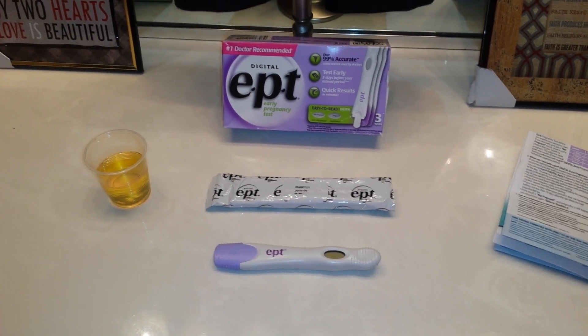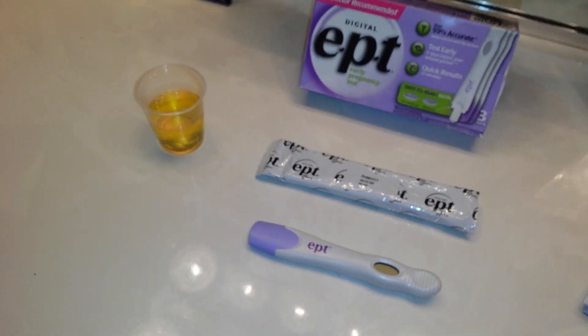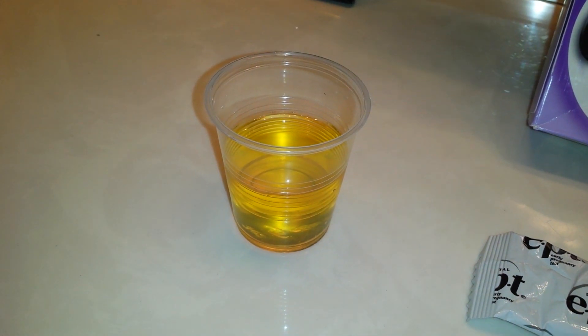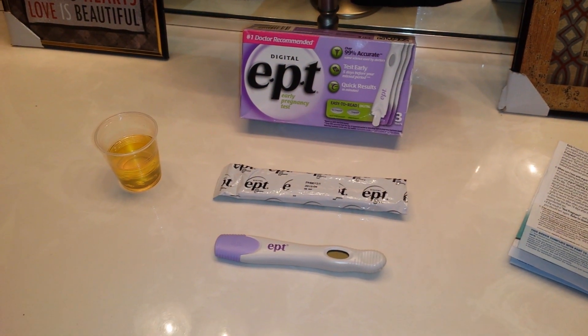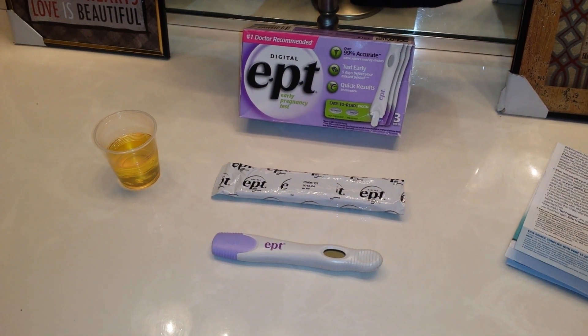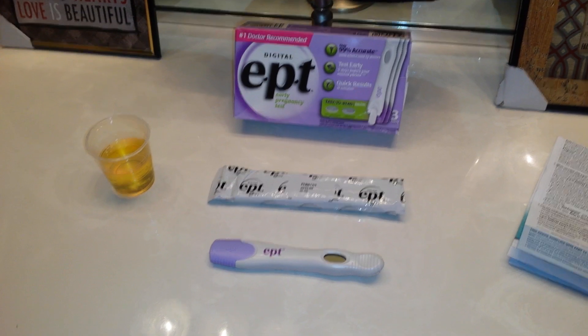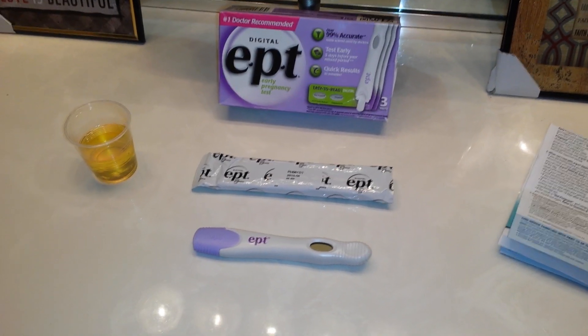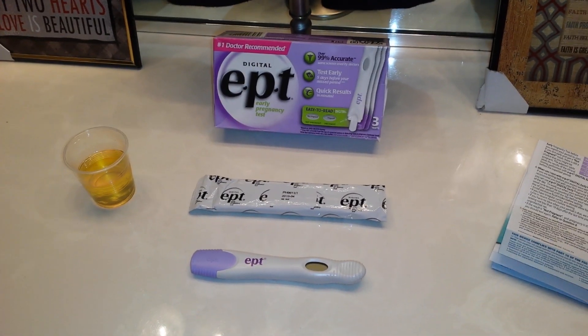I highly advise collecting a sample in a cup rather than using a midstream test directly in your urine stream. As you can see here, a concentrated sample would look kind of like apple cider — a dark yellow. If it looks really clear, I would dump it, save it, do another hold, and try again later.